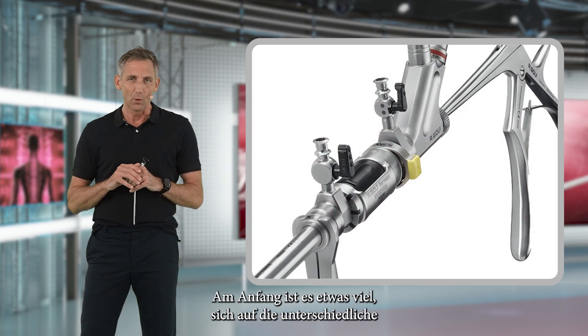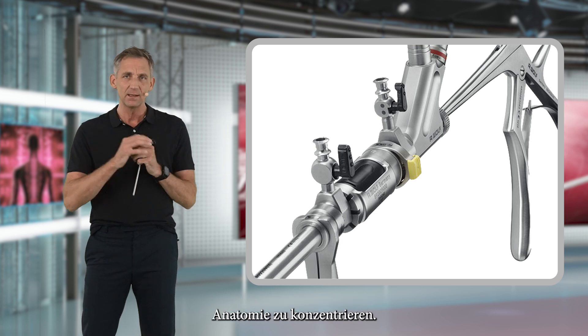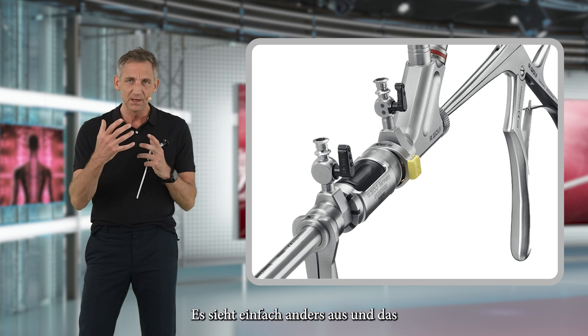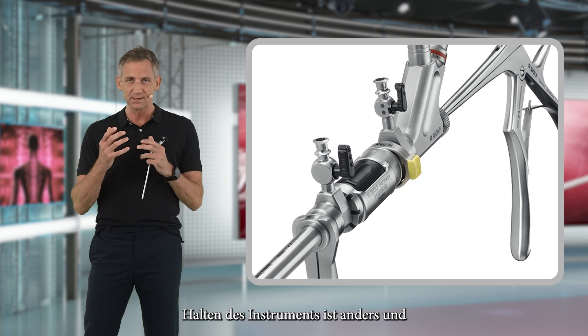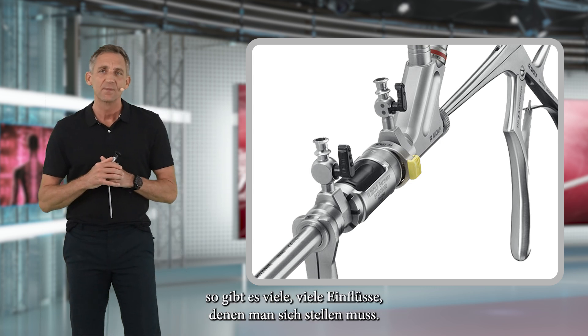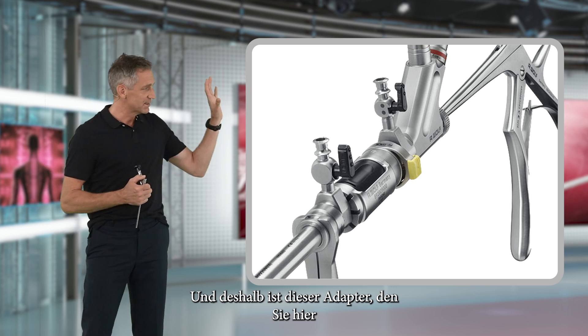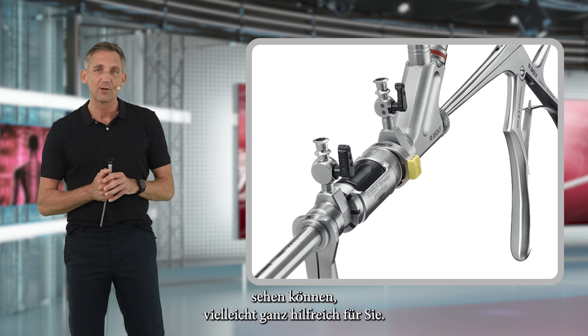In the beginning, this is all a bit much to focus on — the different anatomy simply looks different, and the holding of the instrument is different. So there are just many influences that you have to face. Therefore, this adapter that you can see here may be quite helpful for you.